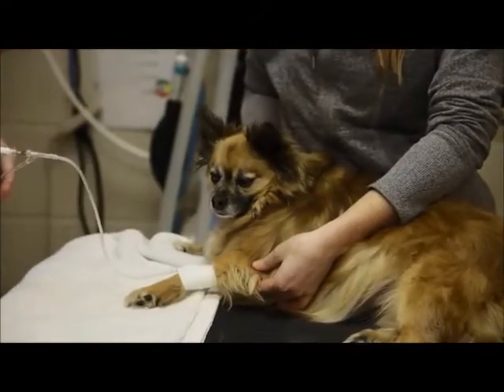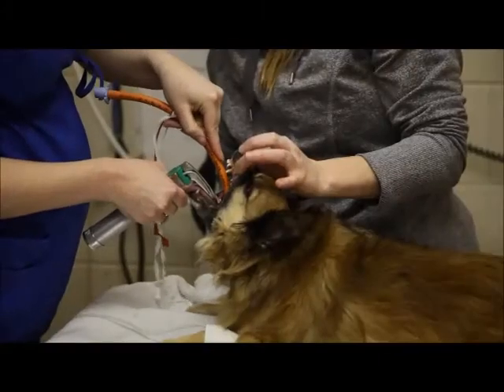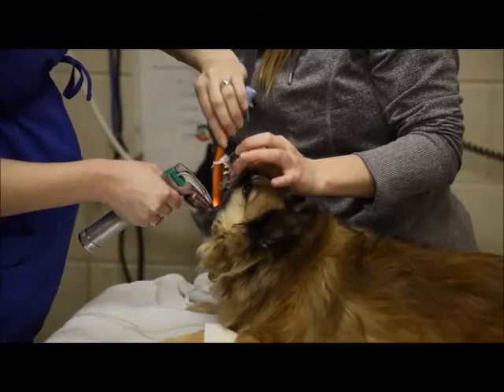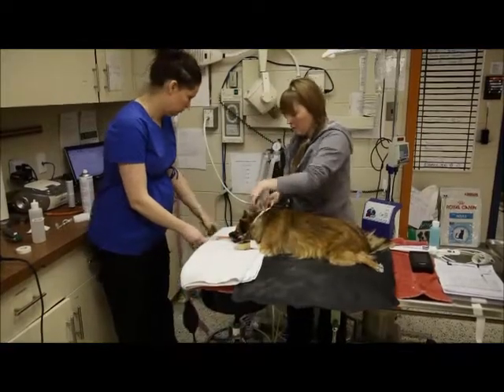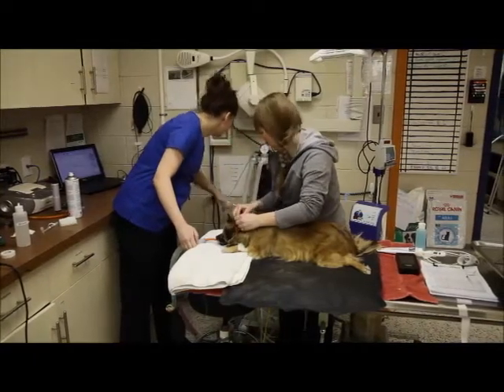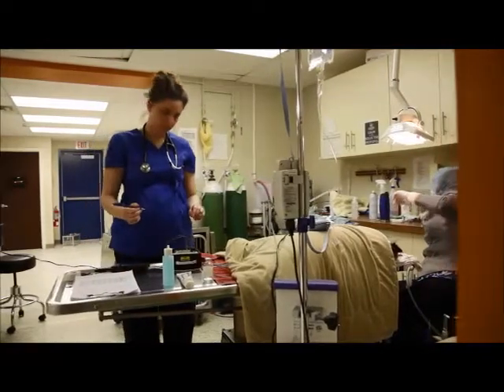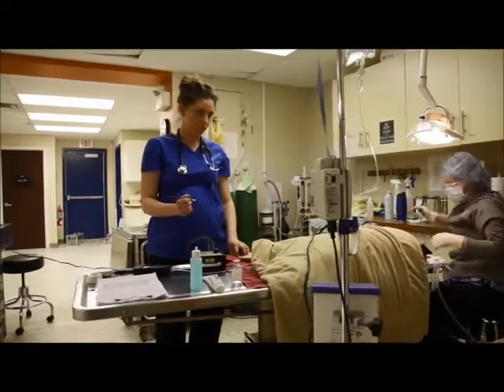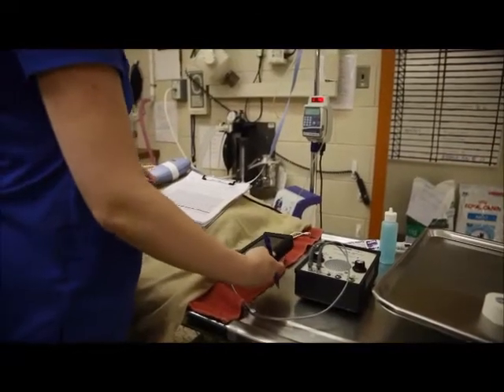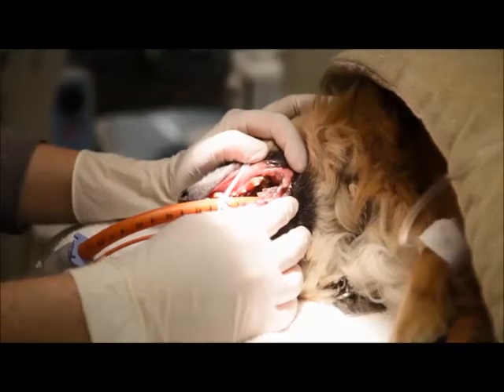Then your pet will be given an injection that gently and quickly anesthetizes them. As soon as their jaw muscles are relaxed, a tube is placed in the windpipe that allows direct and accurate administration of oxygen mixed with anesthetic gas. We use the very safest gas, exactly like what you would have if you needed a general anesthetic. All this time and all through the procedure, a trained nurse will monitor anesthetic levels, heart rate, breathing, blood pressure, blood oxygen levels, and temperature. Safety is our number one priority.